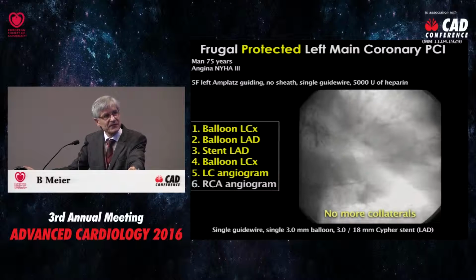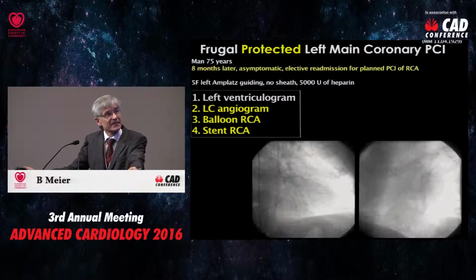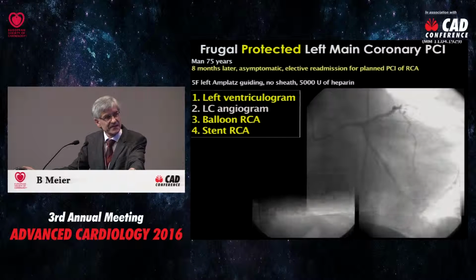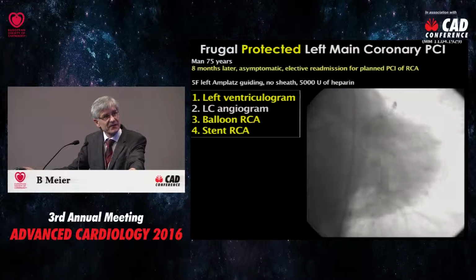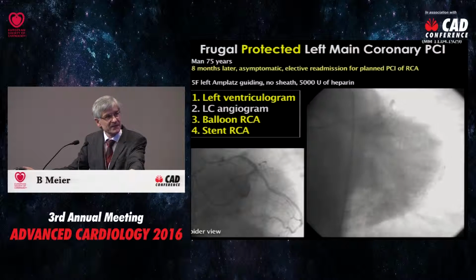Now, nowadays, with the drug-eluting stents, I would certainly do the right during the same session. Then we didn't have those good drug-eluting stents yet, so I called the patient in after 8 months for a second session, again doing the left ventriculogram, this time taking the left Amplatz right away because I knew I was going to dilate the right coronary artery. So that's a sheathless femoral left Amplatz catheter. You can also introduce it radial, of course, if you want. And a normal ventricle first with this catheter, then you put it in the left main. You see a pretty good result 8 months later, so it's past the time period where restenosis can occur, and in another view you see that the result even in the non-stented circumflex looks pretty good.